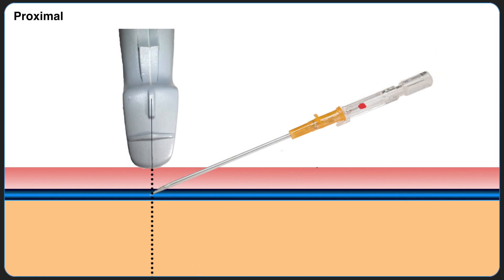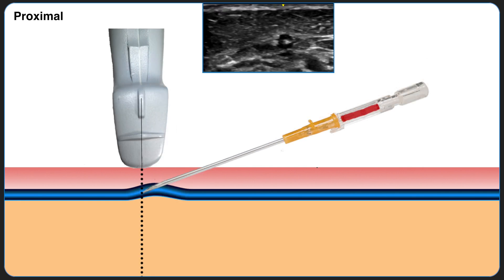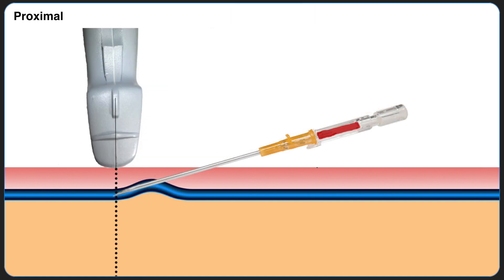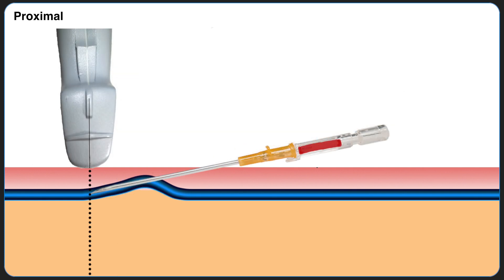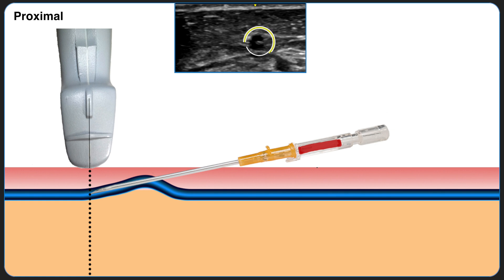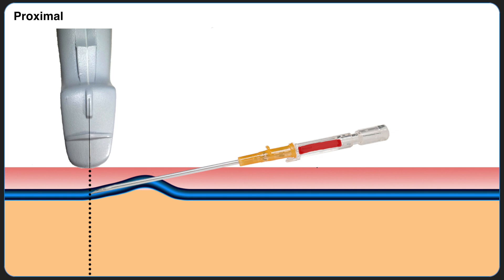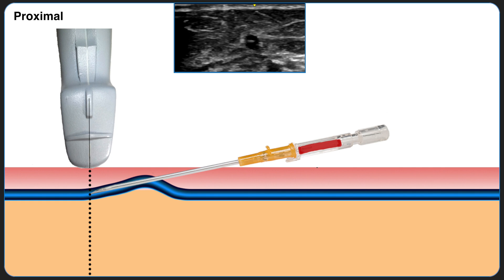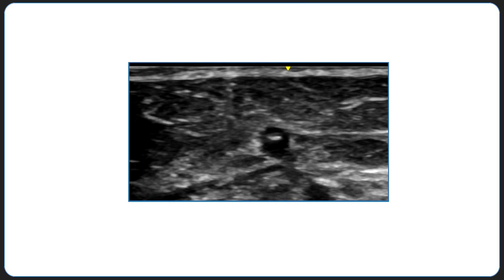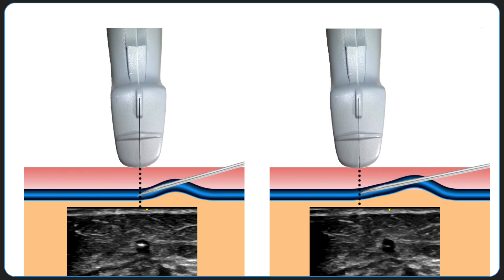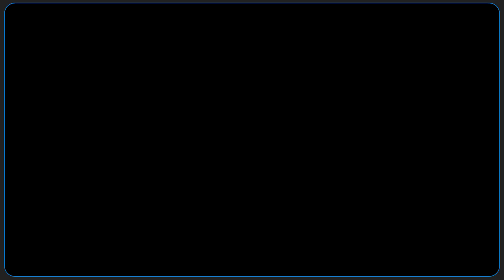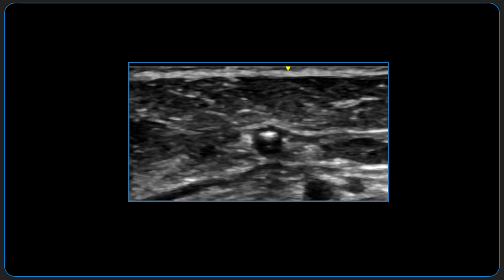The second stage of tracking the bevel is after entry into the vessel itself. Tilting of the probe is less important here due to the echogenicity of the bevel head against the background. The angle may be either maintained or decreased. The body of the bevel is bright and hyperechoic in the lumen. As the transducer is translated proximally, the bevel seen in the lumen becomes smaller and smaller until it disappears. The smallest observable part is the tip of the bevel. Before any advancement of the angiocath, the tip of the bevel should be positioned just cephalad to the center of the vessel. When the bevel tip is visualized and positioned appropriately, the angiocath is then advanced into the vessel until the ultrasound beam cuts again through the body of the bevel. This appears on ultrasound as an enlarging hyperechoic object in the lumen. The transducer is then translated proximally again to visualize only the tip of the bevel. Repeating this process allows for real-time visualization of the angiocath as it is safely advanced into the vessel of interest.